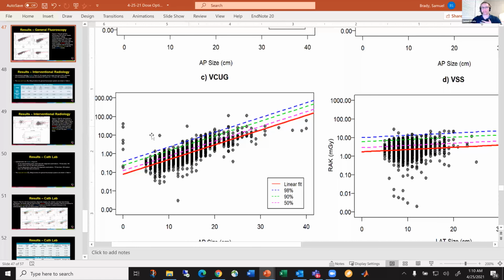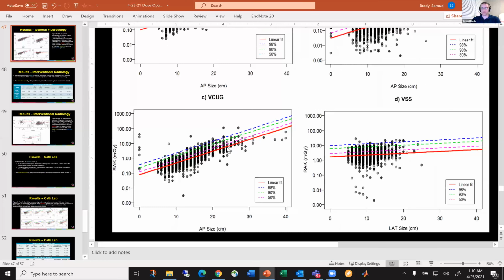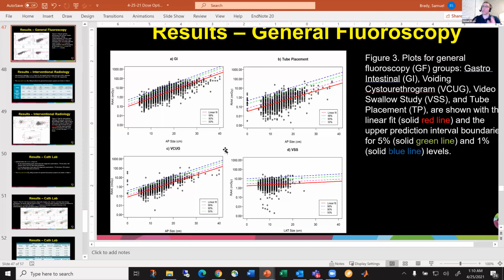But for us, this is something that's important to track because we want to know why those values are high. Why did this patient right here, a teeny little kid, get probably 10 times the radiation dose of all the other kids? There's no reason for that. And so that's why we set up these alert levels. These alert levels are established using air kerma. We only look at air kerma for alert levels. And why is that?